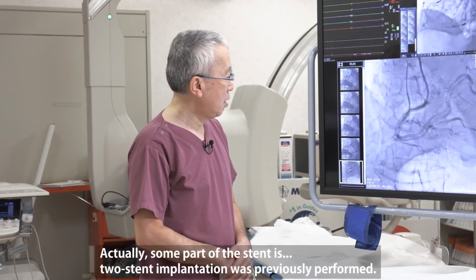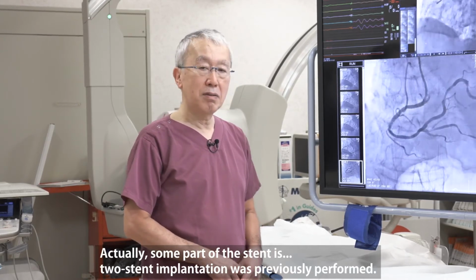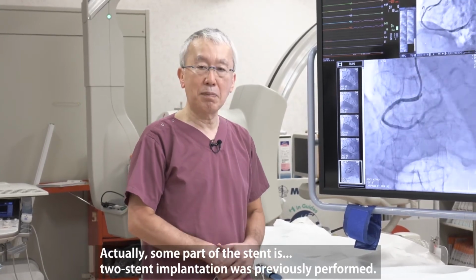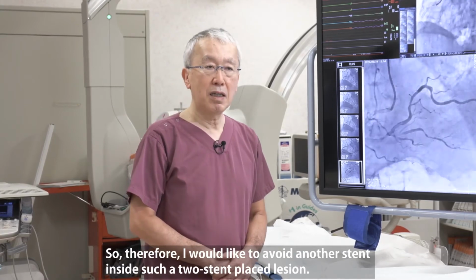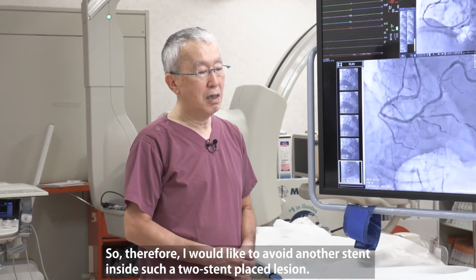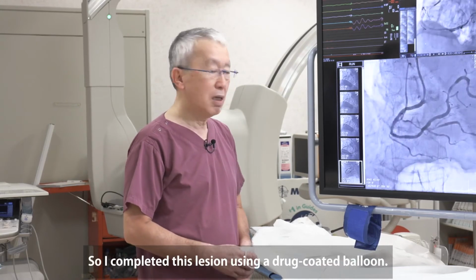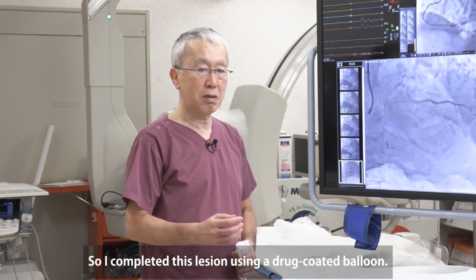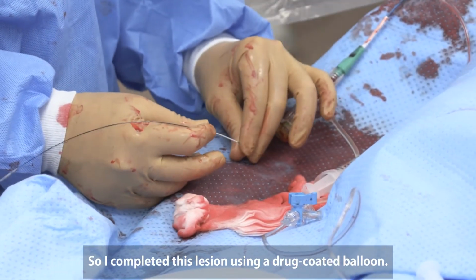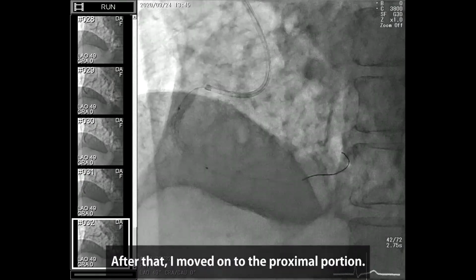Actually, in some part of the stent, two-stent implantation was previously performed. Therefore, I would like to avoid another stent inside such a two-stent placed lesion. So I completed this lesion using a drug-coated balloon. And after that, I moved on to the proximal portion.